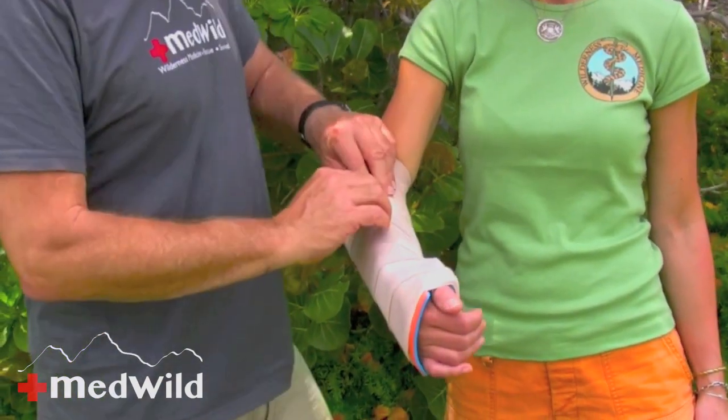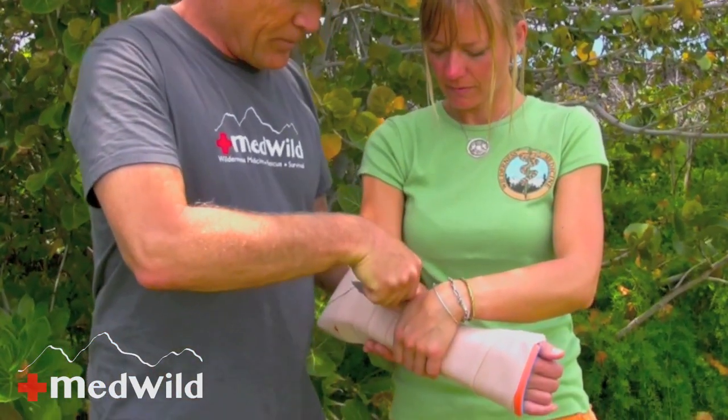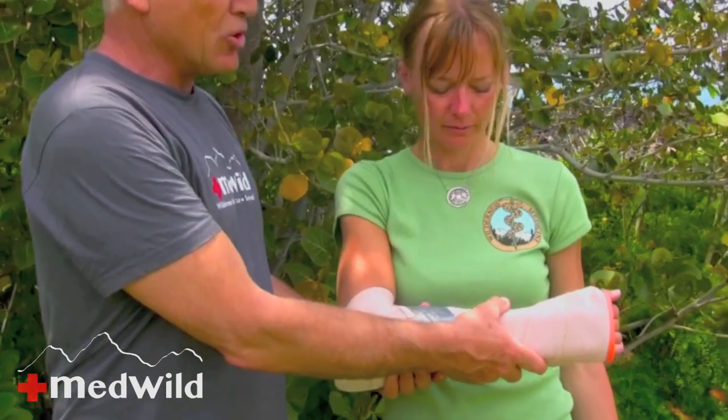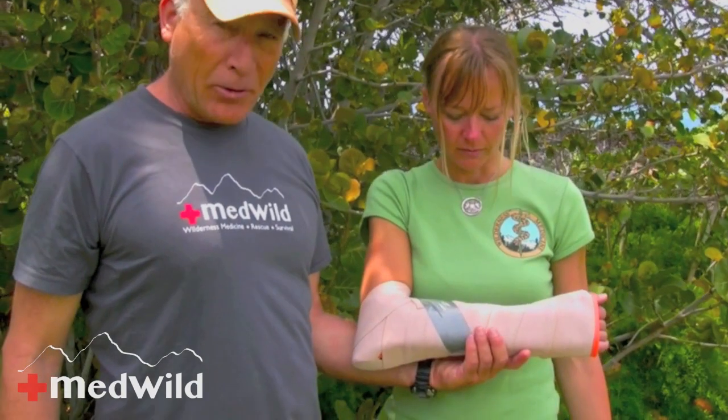At this point I'm going to get some duct tape. You have to have duct tape — it's really hard to improvise. Even birch bark and sap will not substitute for tape; you just have to have it in your kit. Not pretty, but pretty functional. If this was a bad injury and Denise was in a lot of pain, I would put her into an improvised sling, which we'll talk about in another section.